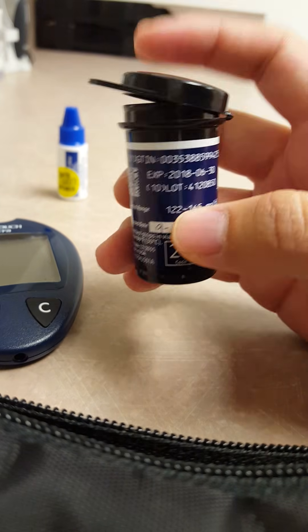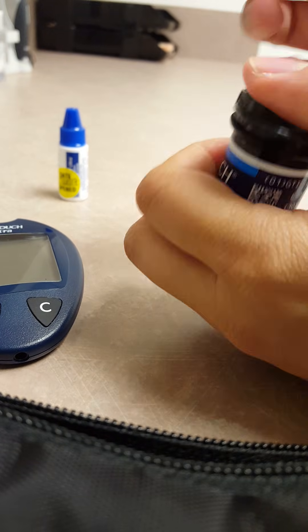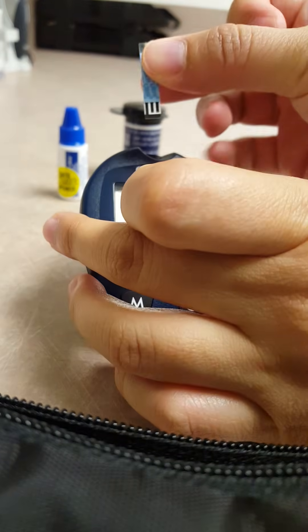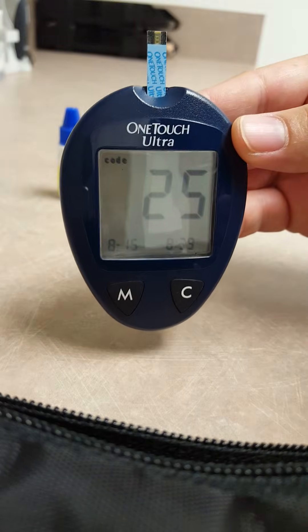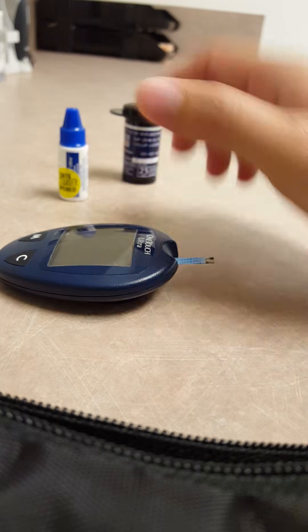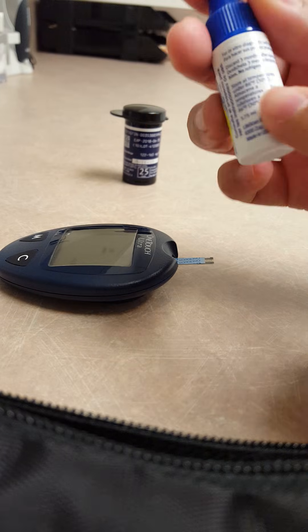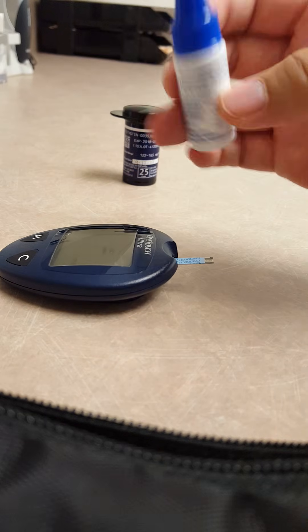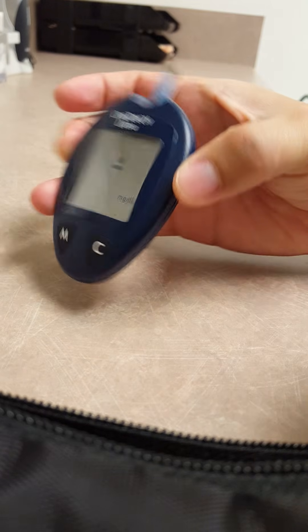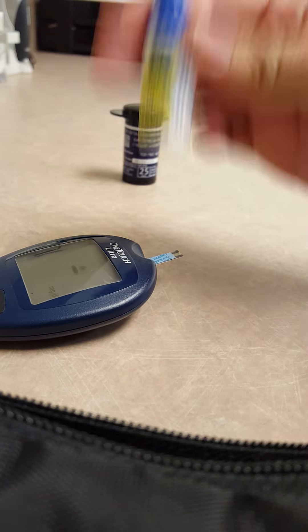So let's get started. You're going to get a strip out and put that into the glucometer. It's going to turn on — now set that down flat. Then with your control solution give it a quick shake. The instructions on the side say shake well and store below a certain temperature — you don't want it to get too hot. When your glucometer is beeping saying it's ready for a drop of blood, in this case it's the control solution.